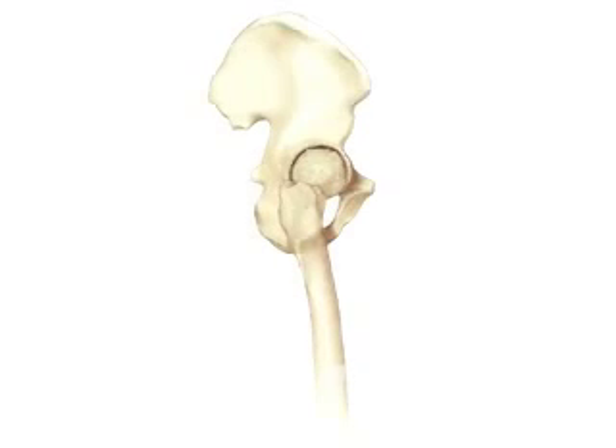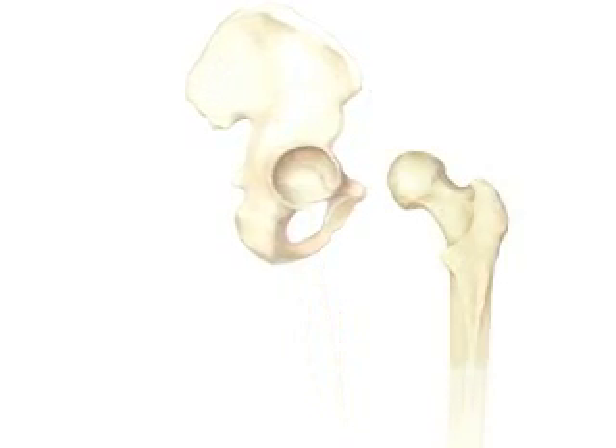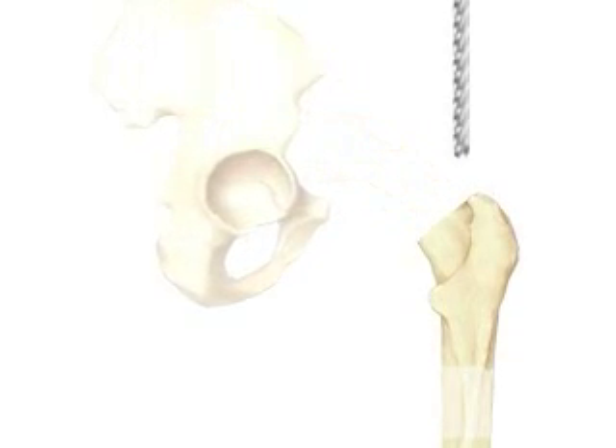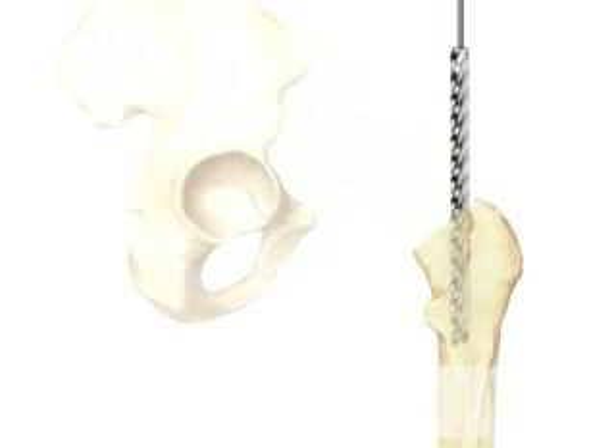Next, the team pulls the top of the thigh bone out of the hip socket. Using a precision surgical saw, your doctor will carefully remove the ball-shaped end of the thigh bone. Then the surgical team will use a high-speed drill to hollow out the top of the thigh bone.